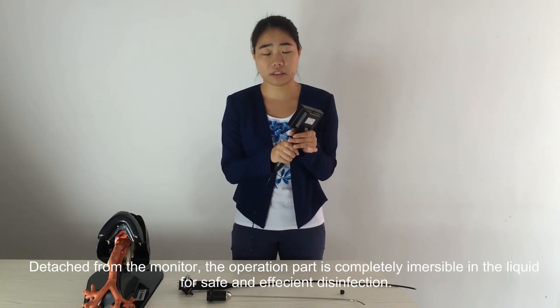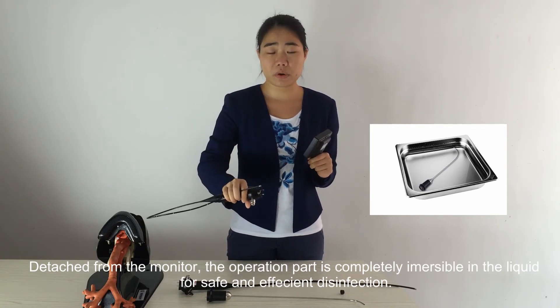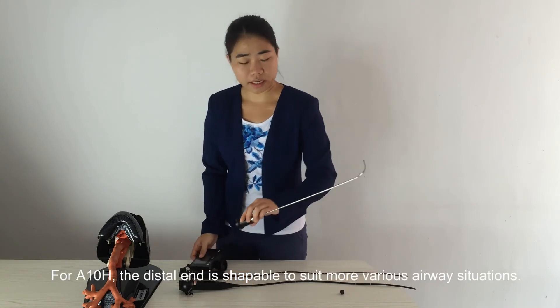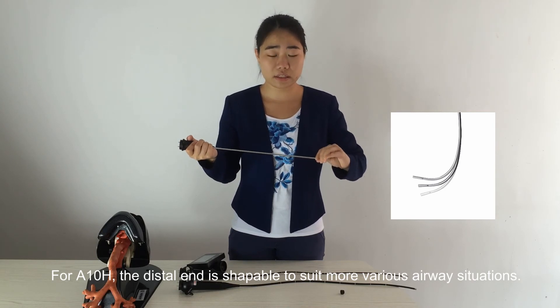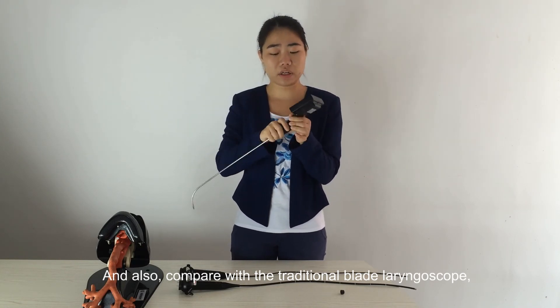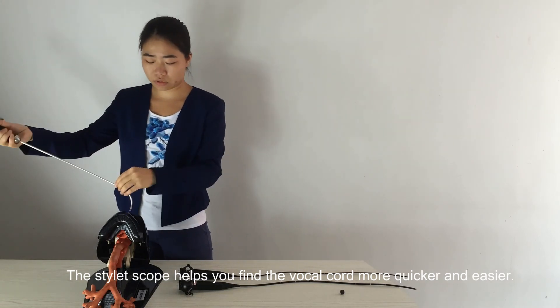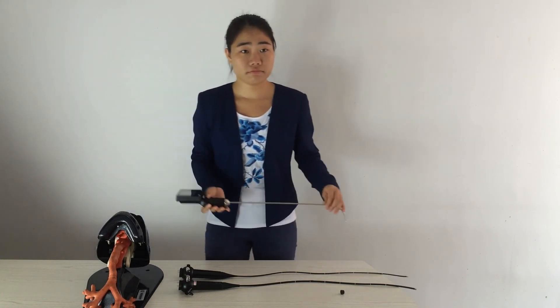Detached from the monitor, the operation part is completely immersible in liquid for safe and efficient disinfection. The distal end is shapeable to suit more airway situations, and compared with traditional blade laryngoscope, the stylet scope helps you find the vocal cords more quickly and easily.